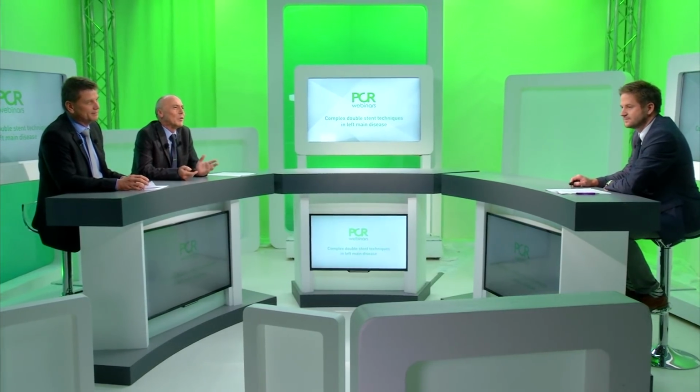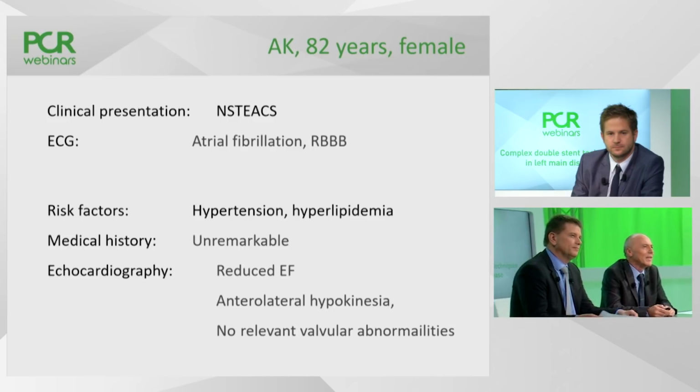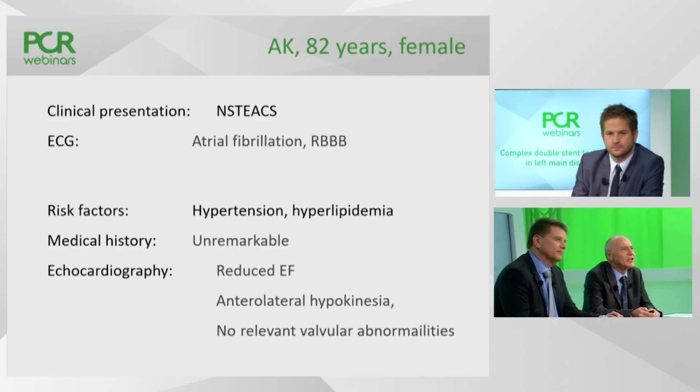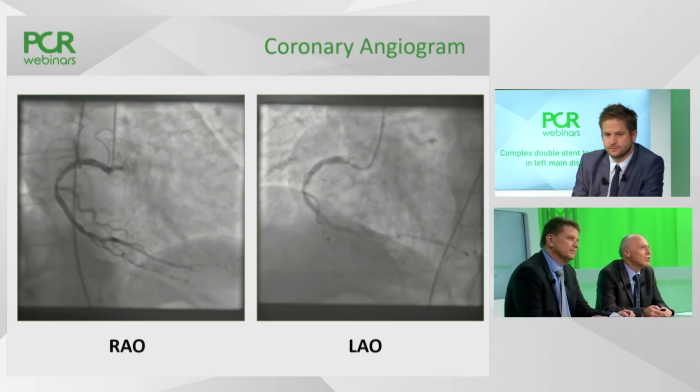So let's go with the first patient. So, 82-year-old lady, clinical presentation high-risk non-STEMI, and a little bit reduced left ventricular ejection fraction with anterolateral hypokinesia. So let's go to the angios now.